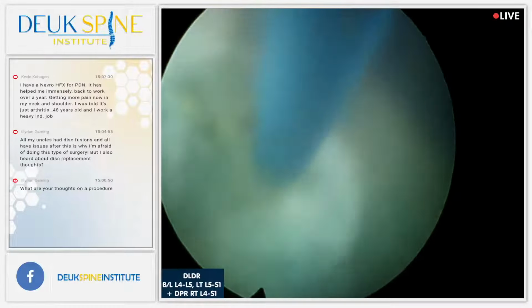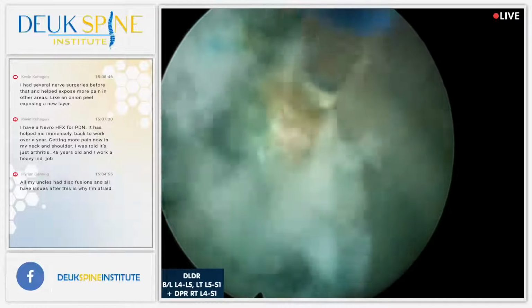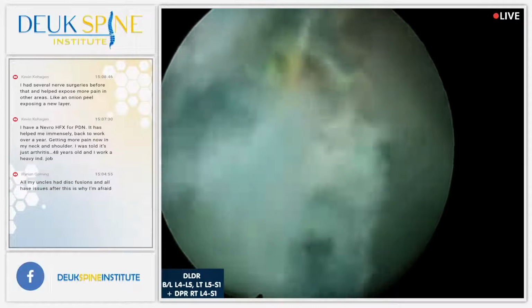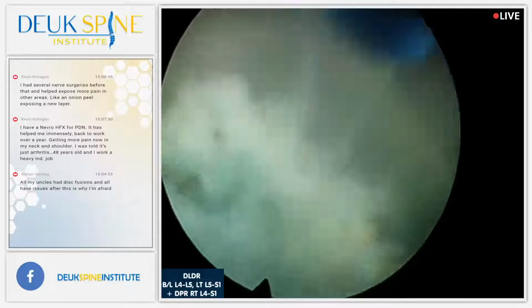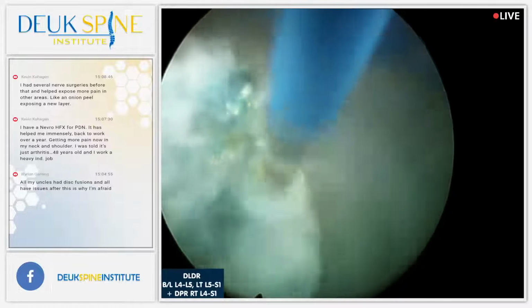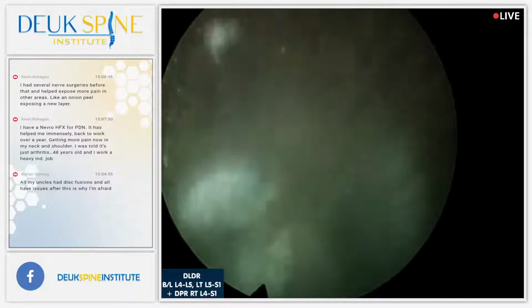And now he has pain below the fusion at L4-5 and L5-S1. We call it adjacent segment disease. Now, he says he never got better with the fusion at all. I believe him. And that means that the doctor that did the fusion did the wrong level, didn't fuse what they were supposed to. They should have done all the discs, they only did one. My point is, fusions are bad, and I don't recommend them, okay? I recommend them only once in a blue moon and only for patients that cannot do the laser.